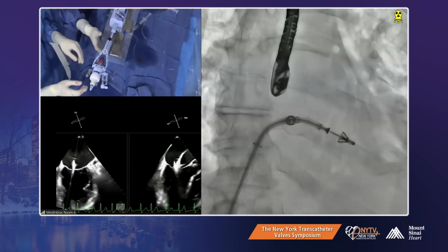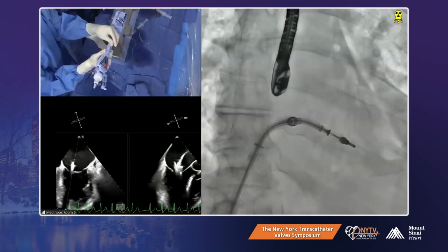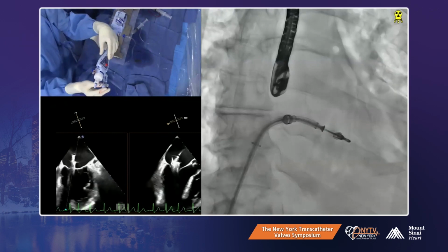Yeah, we're going to determine that in a moment. But trajectory, I think, for now, is diving a little bit medial. That's my concern. Right, right. You're going to go more medial as you go in. We'll figure that out in a moment, but we just want to quickly check the clip gripper orientation.